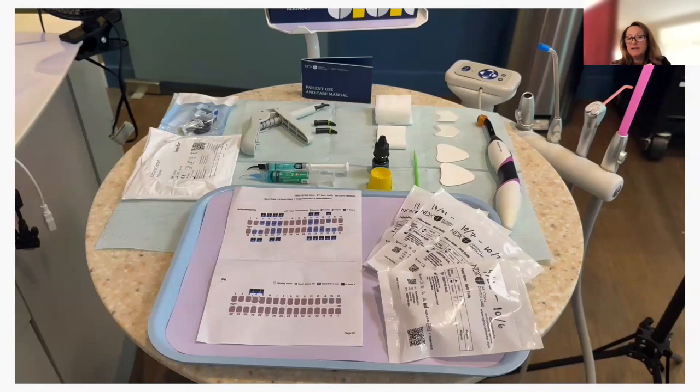But isolation is so important because if you have any saliva or fluid that has contaminated it, those attachments will pop off. So I will usually load my tray on one side of my template, then I will put it in a box. You can find dental resin shading boxes.